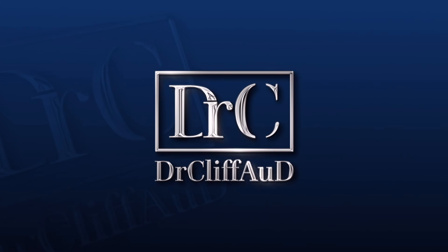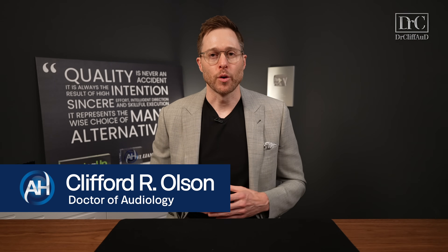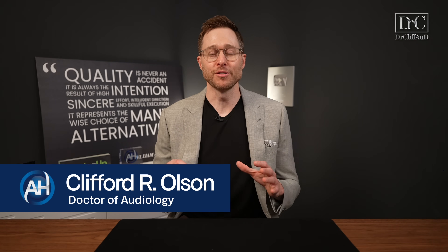This little device is an absolute must-have if you want to significantly improve your streaming sound quality. Hey guys, Cliff Olson, Doctor of Audiology and founder of Applied Hearing Solutions in Phoenix, Arizona, and in this video I'm doing a detailed review of the new Easy-LE Bluetooth Adapter from Oticon.